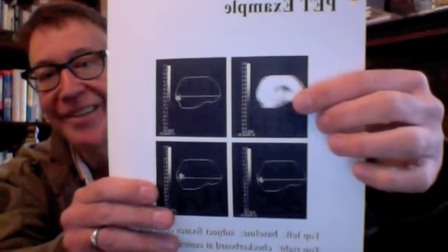So the control condition here, the subject just looks at the screen, just stares at the screen, right? Just a blank screen. So when you're just staring at a blank screen, there is going to be activity, there's going to be blood flow in your brain, obviously. And this radiolabeled chemical that's been injected is going to be circulating in that blood. So you're going to get a signal. So this is your sort of baseline signal, right?